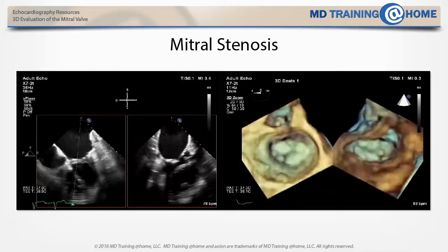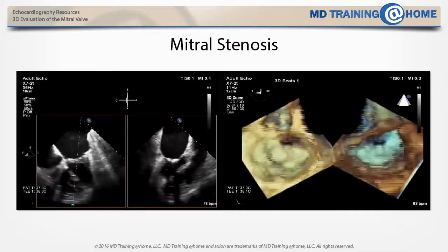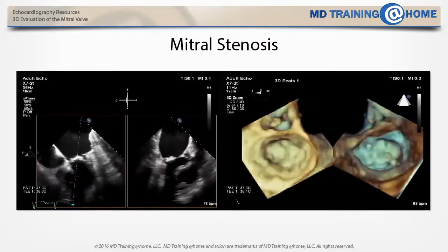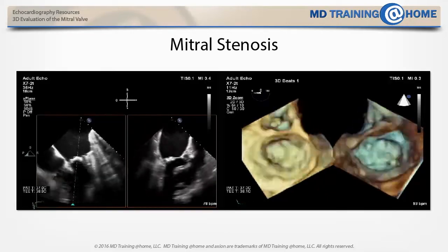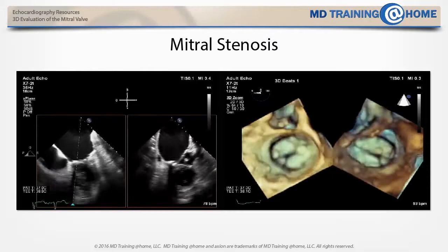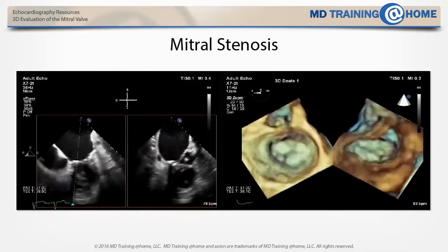The presence of these characteristics alters the normal, rapid, biphasic motion of the valve. The restricted opening of the diseased anterior and posterior leaflets results from reduced commissural separation from partial fusion and chordal foreshortening, therefore causing the leaflets to open with a doming motion.